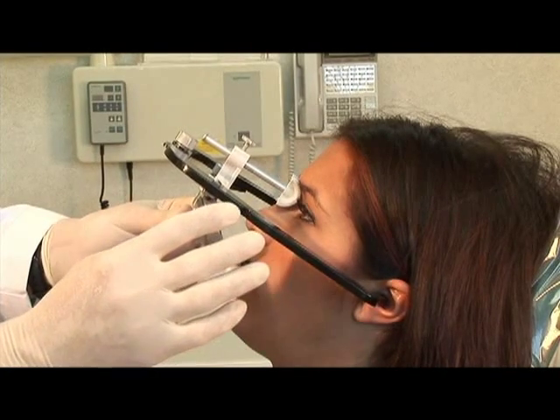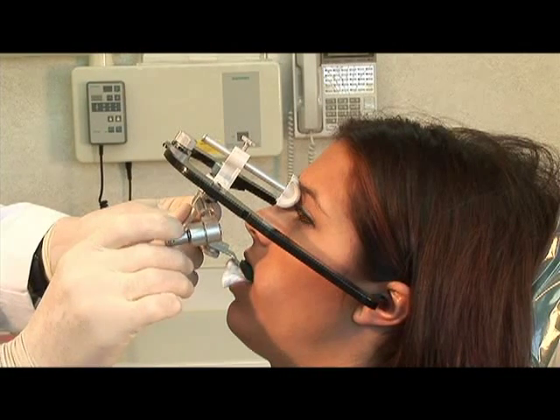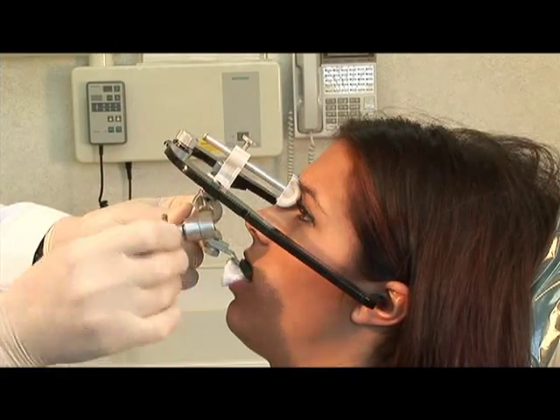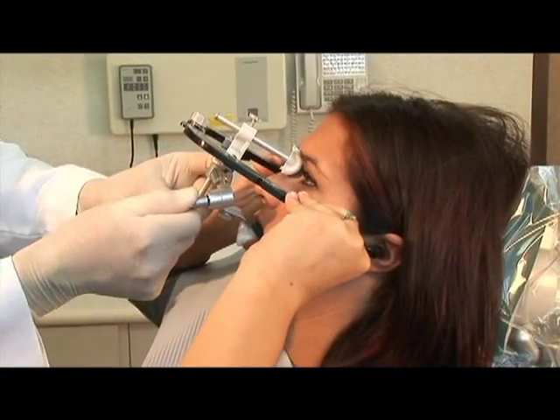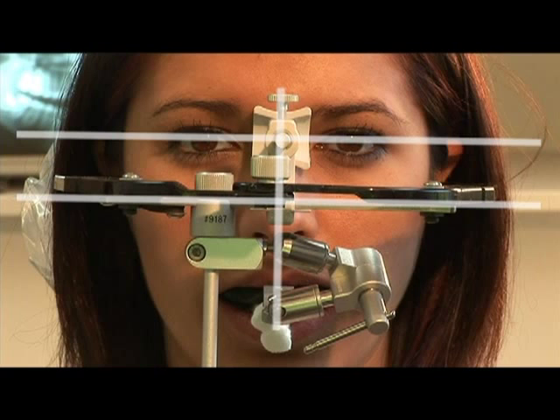Once the facebow is in place, gently tighten the toggle, taking care not to tilt the facebow. Next, have the patient gently hold the facebow arms to stabilize it as you finish tightening the toggle. Here we have the completed facebow transfer. Note that the facebow is centered on the patient's face and the transverse bar is parallel with the interpupillary line.